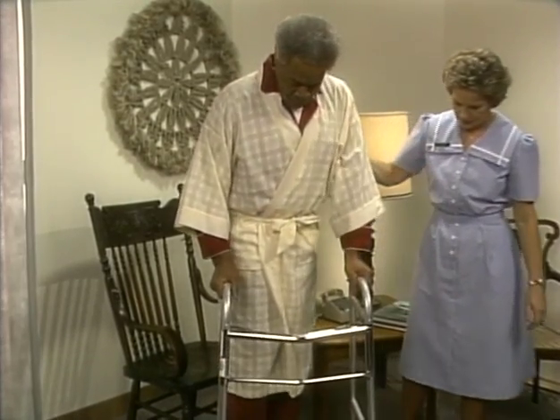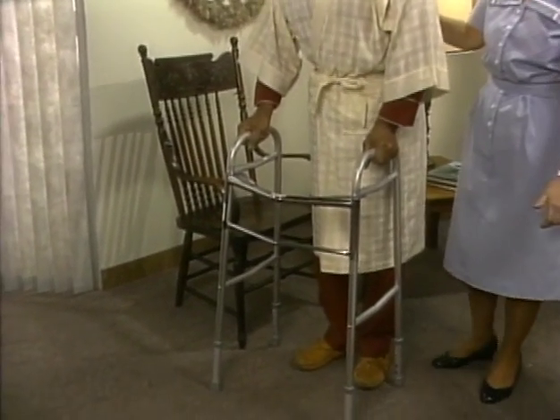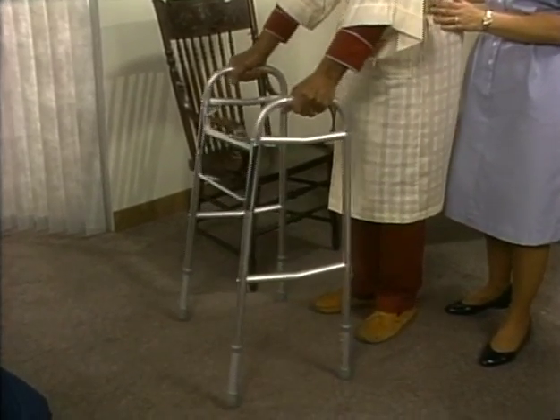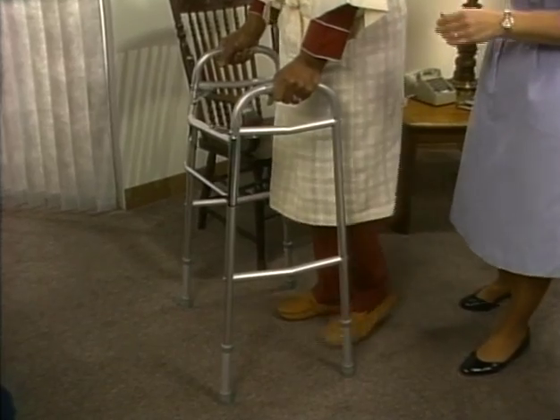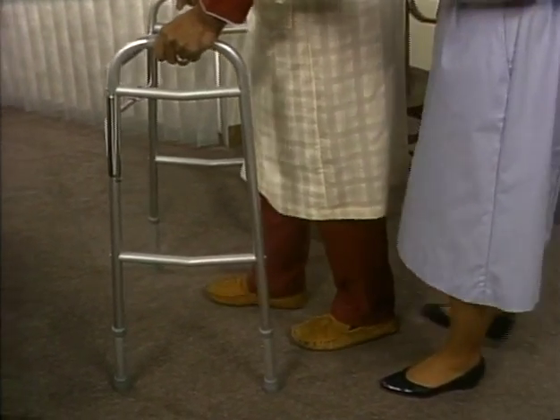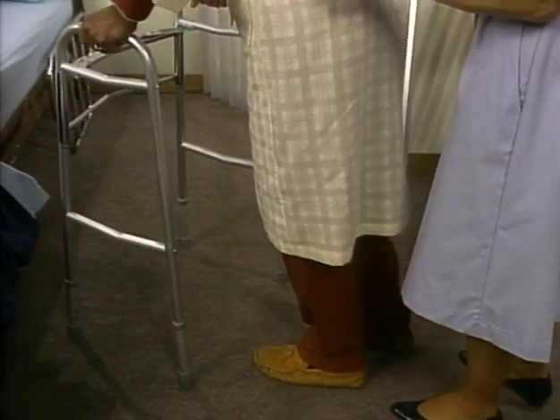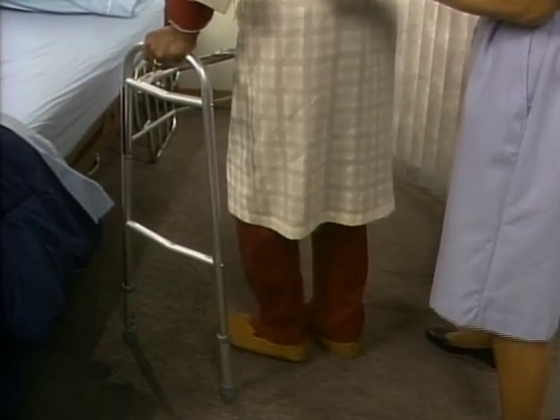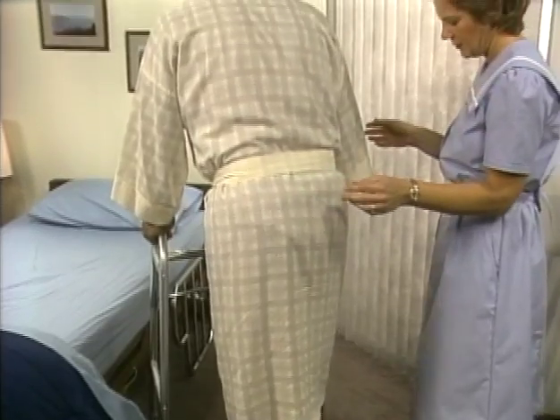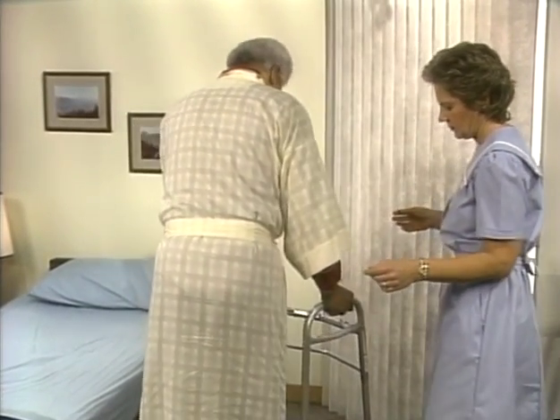To walk with the walker, the patient should pick it up, reach it out to advance it 8 to 10 inches, and place it firmly on the ground. The patient should use his arms, elbows, and shoulders to advance the walker and not lean forward with his body. Then the patient steps into the walker with one leg, followed by the other leg. If the patient has a weak or injured leg, he should advance that leg first, transferring weight onto the hand grips. This helps him to keep his balance and protect the injured leg.